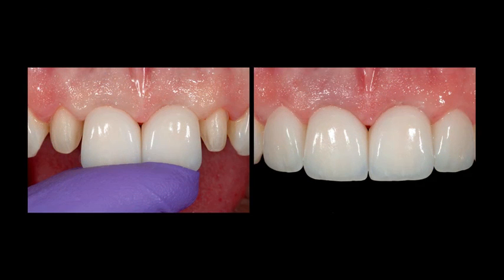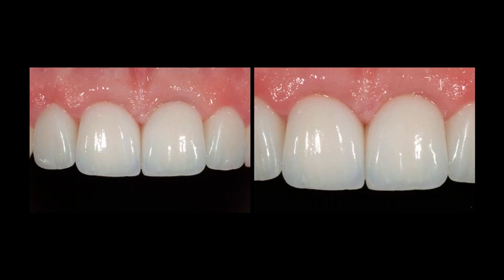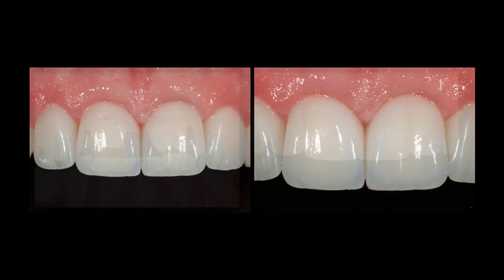When I put in the final crowns, there was a little blunting of the papilla, but I thought it was so small that the tissue would recontour and fill that space in. So we just said we'd leave it for a week or two. Patient came back a week later and the tissue has filled this space in. So it looks good. Now if it didn't fill it in, I could send the crowns back and have the contact point extended and the space closed, but I ideally didn't want to do that. I wanted to give the tissue a chance to fill in around that space.